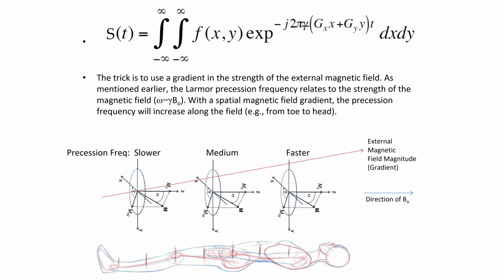Now, what note they're singing would show their position in the choir. If they're singing a high note, they might be towards one end of the choir. If they're singing a low note, they would be towards the other end of the choir. So again, the frequency shows the position. Now, the resonance strength of the T2 signal, the duration that they sing after I pulse them, that is the strength of the signal, or in other words, the pixel intensity, whether it's white or whether it's darker.